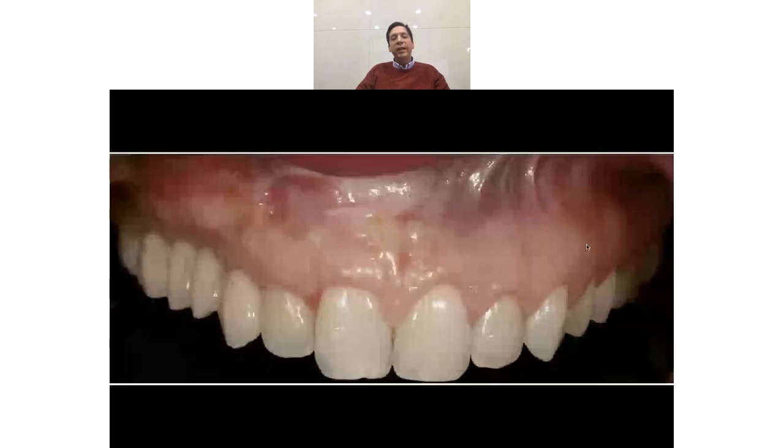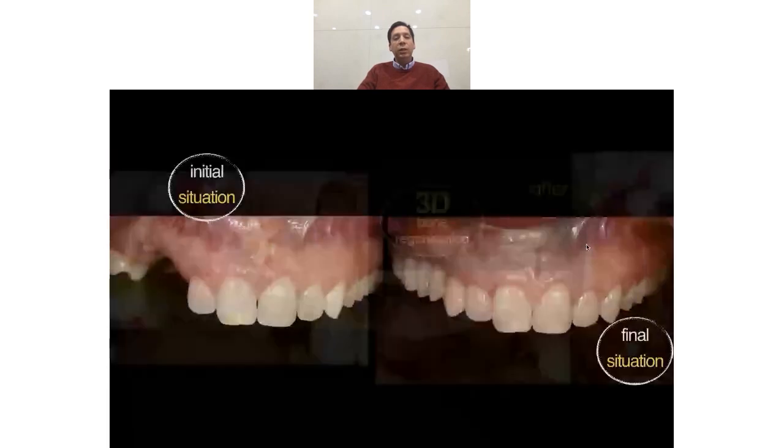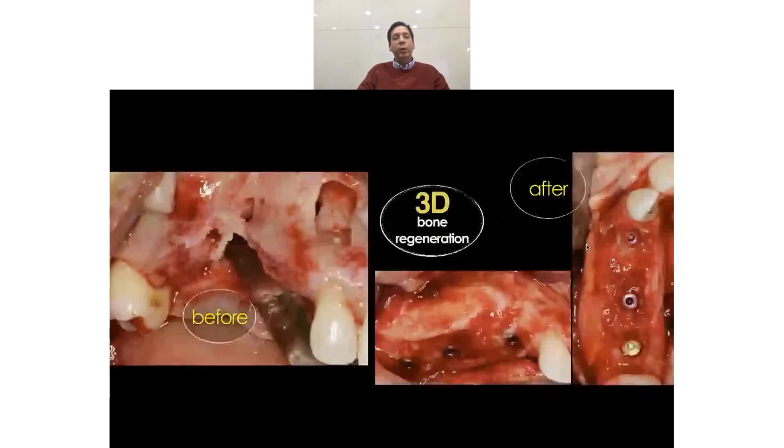So this is the healing. And here we can see the final result. We can see a nice canine that is very symmetric to the other, and there are the other teeth. And remember the starting point and the final point. The starting point on the left and the final result on the right side. A complete three-dimensional bone regeneration.